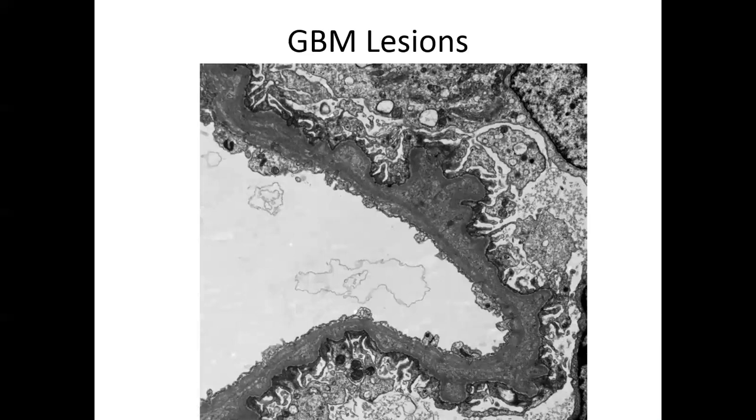Just more glomerular basement membrane lesions that have no evidence of electron-dense deposits, and the IFs were completely negative. So again, you can have abnormal GBMs, and that can cause podocyte damage, or it might be associated with podocyte damage. It might be due to podocyte damage, because as we said, the podocyte makes the GBM. And so it could be a vicious cycle as well.